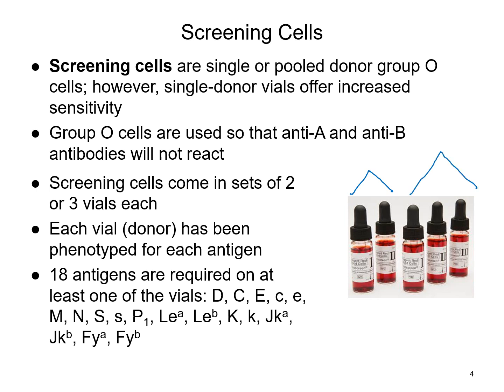Now, I would make a note that this is not a very good image of these reagents. They look like they've probably just been sitting in their rack, so the cells have settled down to the bottom of the reagent vials. But something I want you to make a note of is that all of these reagents do look hemolyzed.